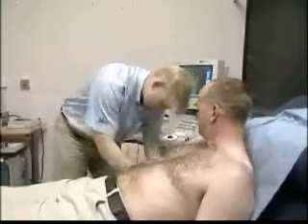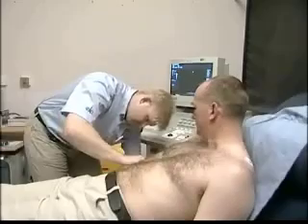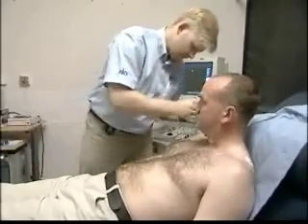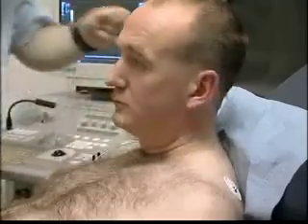ECG electrodes are attached to the patient to record the electrical signals from the heart. This allows the ultrasound images to be linked to the heart cycle.